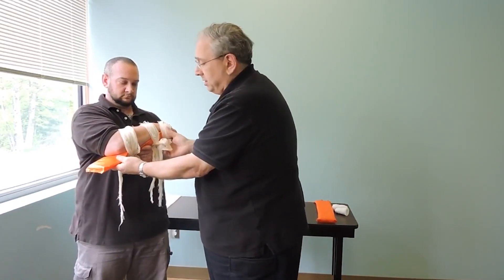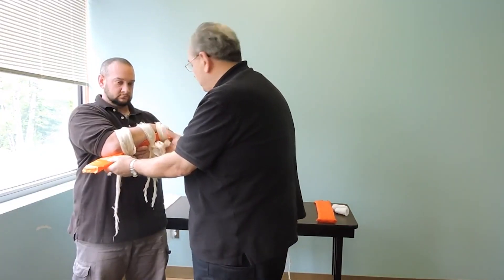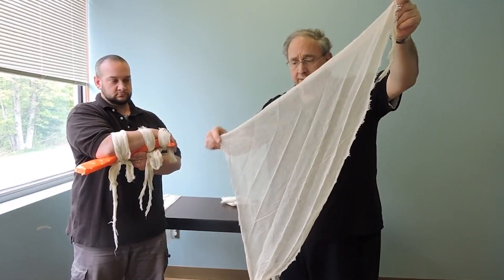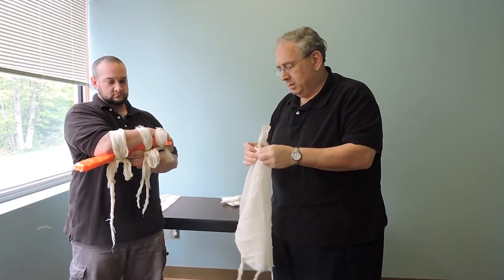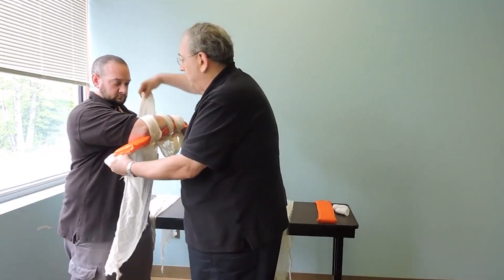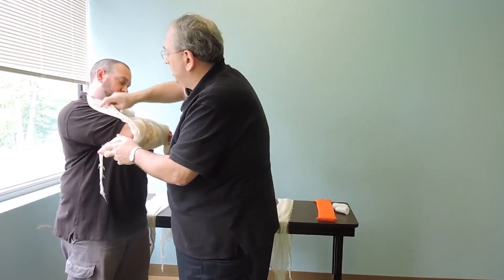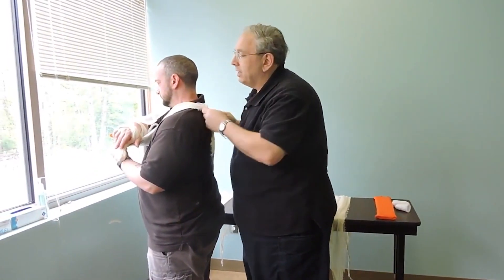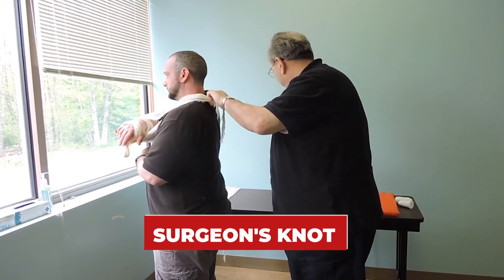Now my patient's arm is immobilized but I need some support. My partner's still holding stabilization. I'm going to tie the sling — take the long side, take the corner against the longest side, and tie it. I'm doing a sling and swath like we did in the first video. One side up over the end, the other side I'm going to grab the board and put it on. I'm going to tie this with a surgeon's knot and add a piece of padding behind for patient comfort.